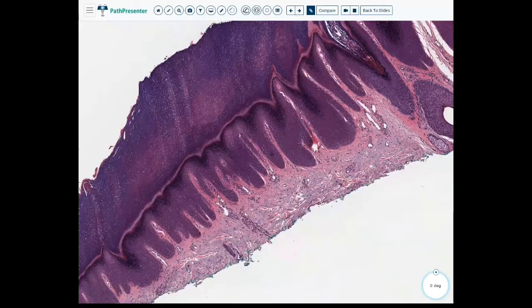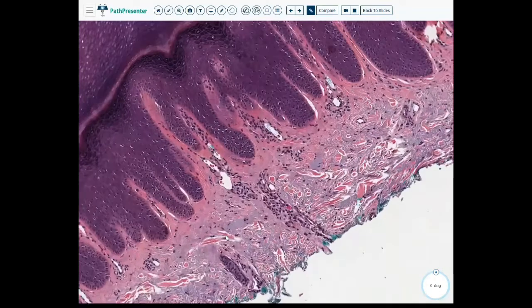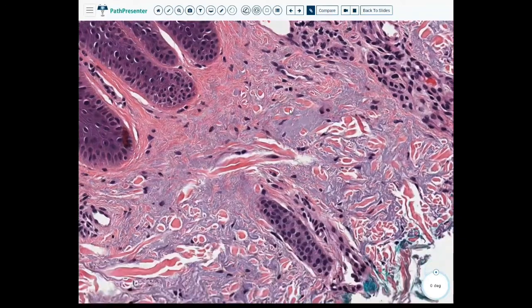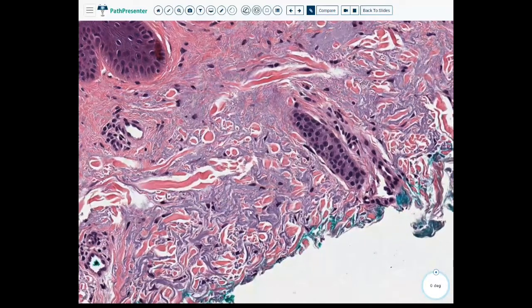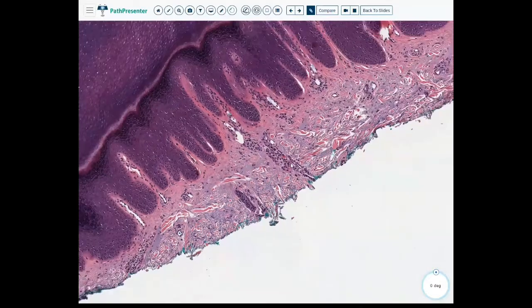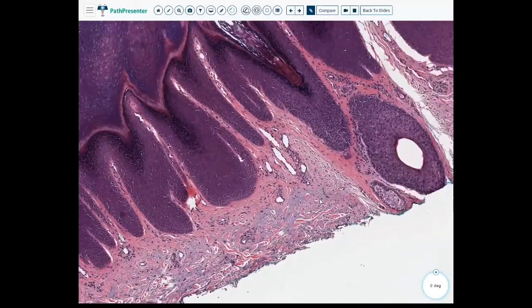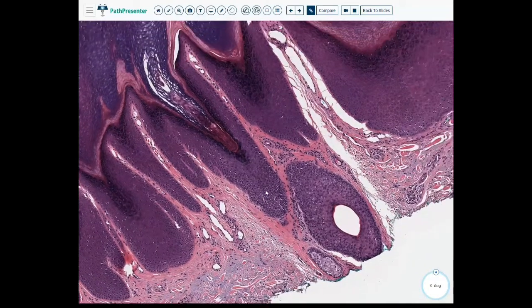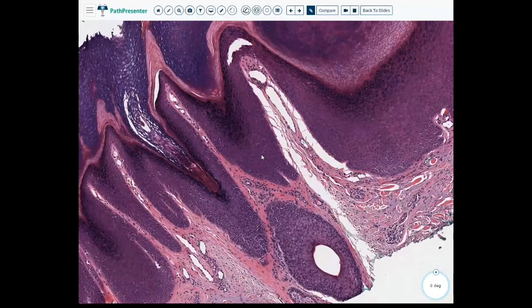And this blue-gray that you see down here, this is actinic change, actinic damage, or solar elastosis. It has this blue-gray look to it, but it's kind of amorphous, kind of wispy in these areas, so it's not a sign of invasion. This is due to actinic damage. This is an area that's exposed to UV, and there's been changes within the dermal layer itself.